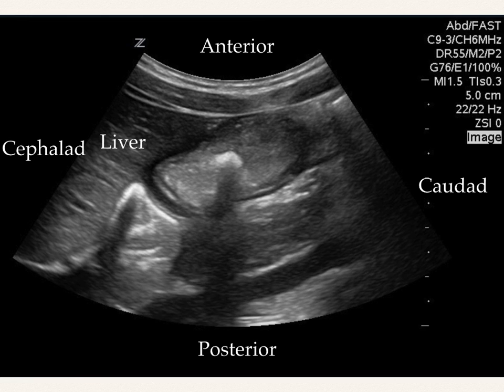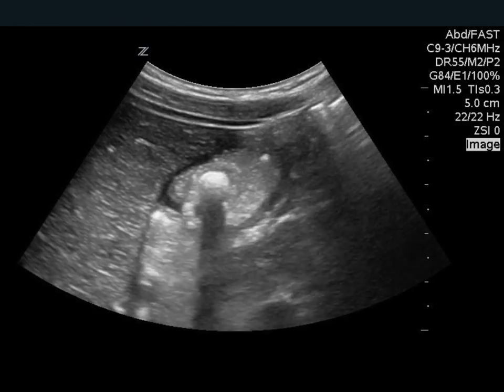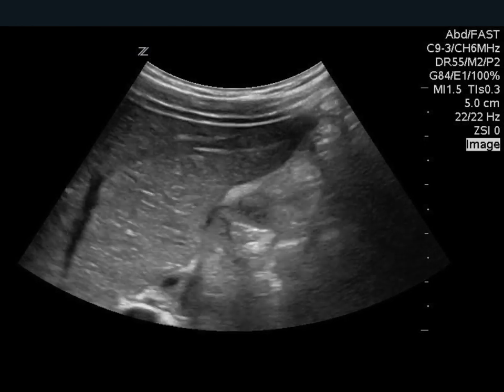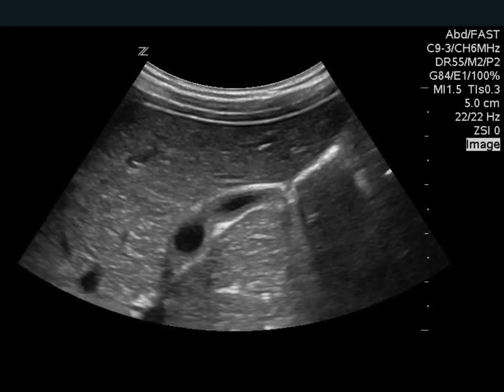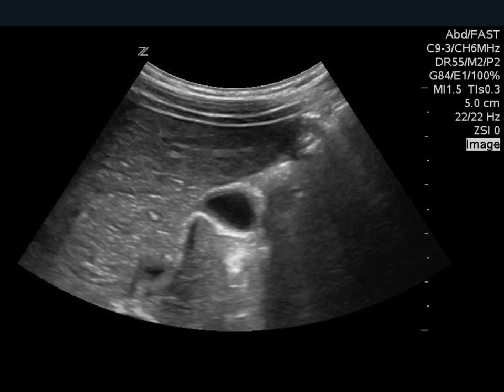So, this is going to be the duodenum. And the reason we know that, even from this picture where we're not following it to the portal triad and we're not following it back to the stomach, is the fact that the outer wall is hypoechoic. The duodenum, hypoechoic; the gallbladder, outer wall, hyperechoic. I realize I'm getting a little off topic from the wall echo shadow sign, but again, this clip is just to show the gallbladder wall that we see initially, hyperechoic, and the duodenal outer wall, hypoechoic.